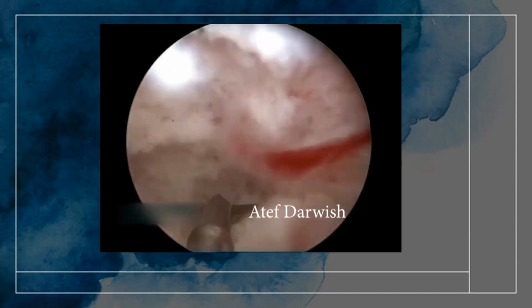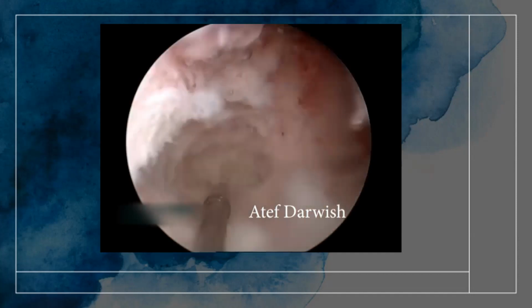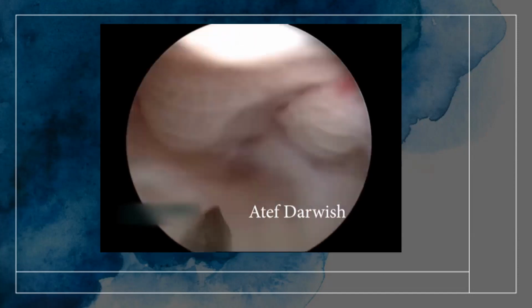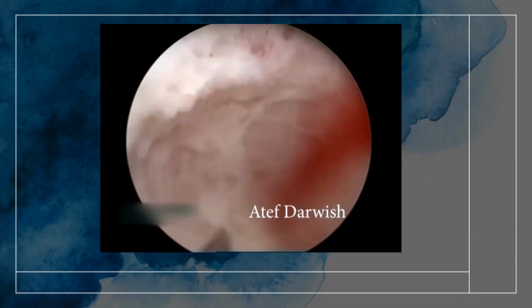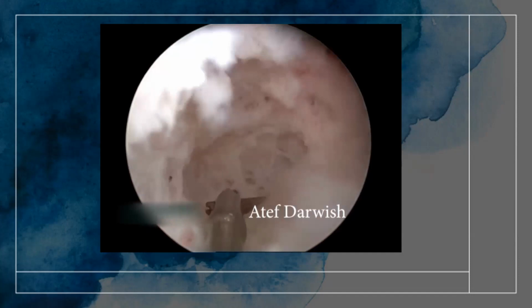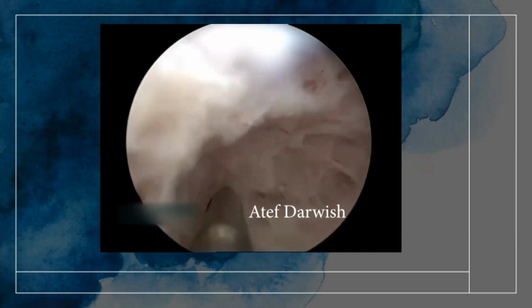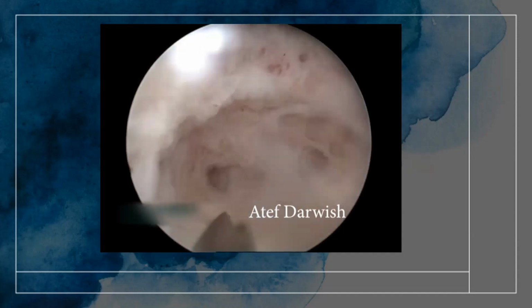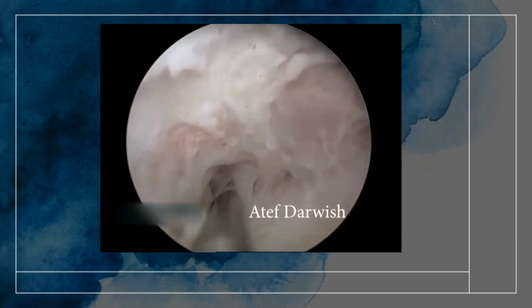You should focus on the adhesions, and the adhesions are whitish, thick, avascular tissues, as you see in this view, while the endometrium is healthy and vascular, and bleeds on touch. In this way, you expose the ostium, which is the base of the Darwish Hysteroscopic Triad, and you can reach the summit of the triad, and fertility of this patient now becomes normal.